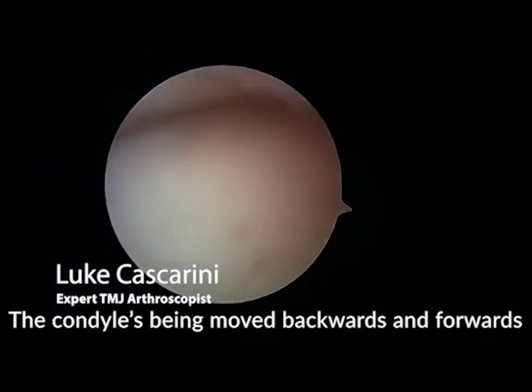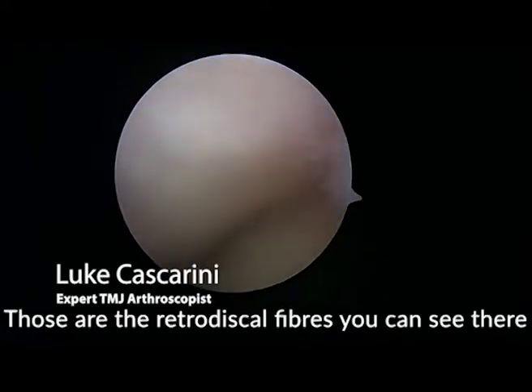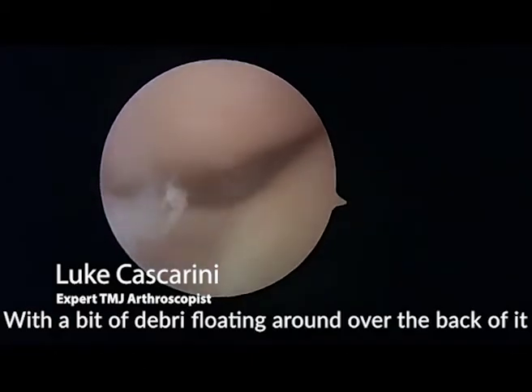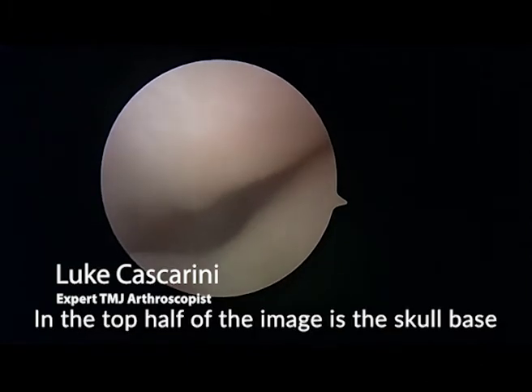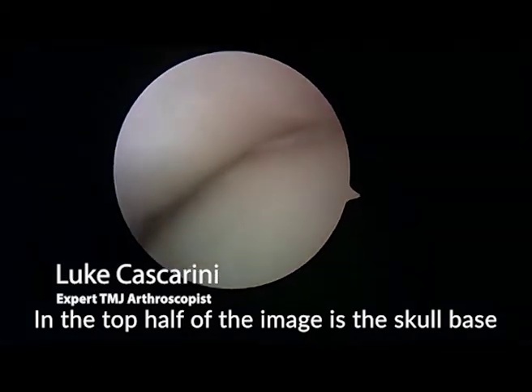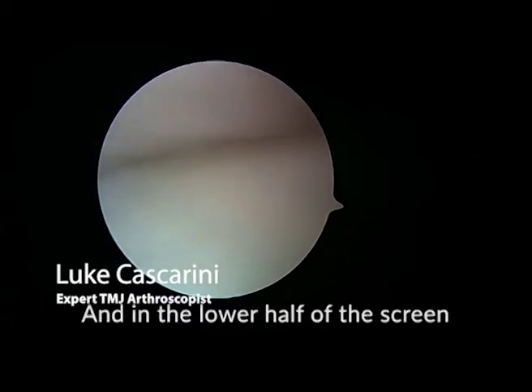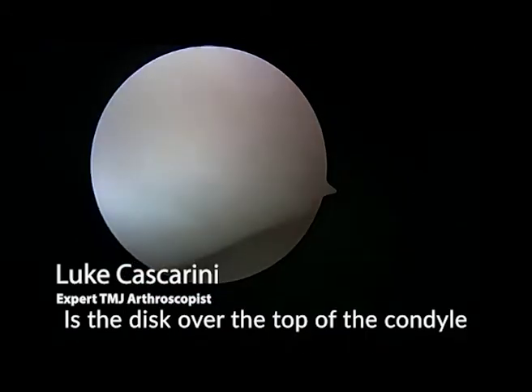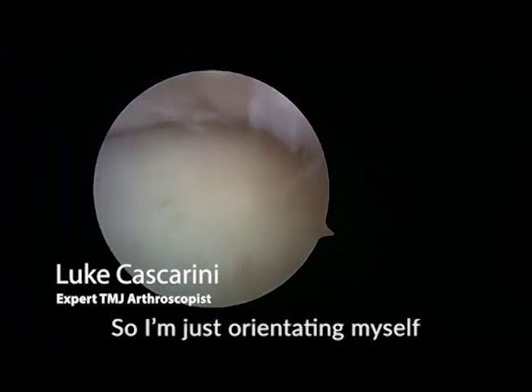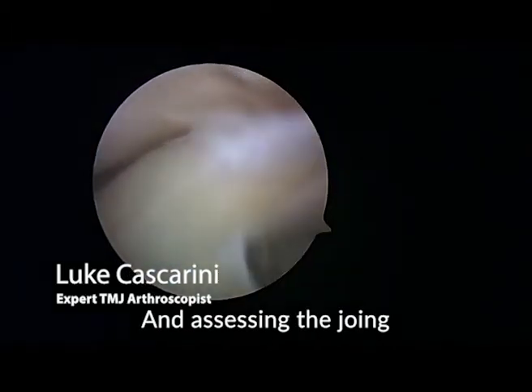At the moment the condyle is being moved backwards and forwards. I'm washing the debris out. There's an outflow needle in, and those are the retrodiscal fibres you can see with a bit of debris floating around over the back. In the top half of the image is the skull base — essentially the fossa of the joint and the articular eminence — and in the lower half of the screen is the disc over the top of the condyle. I'm just orientating myself, washing things out, and assessing the joint.